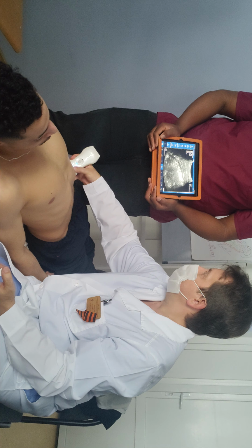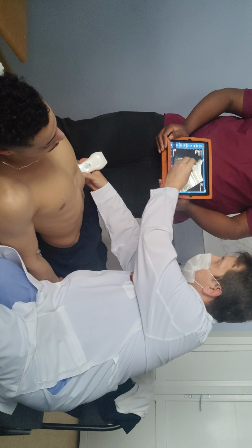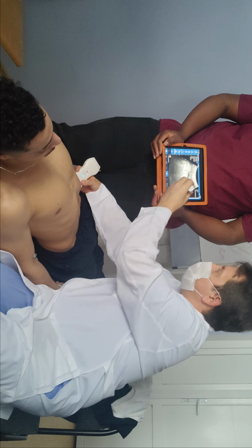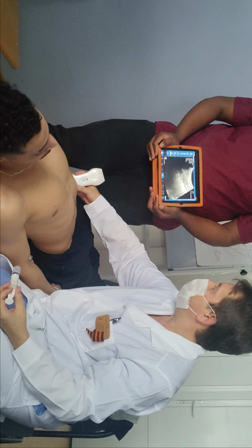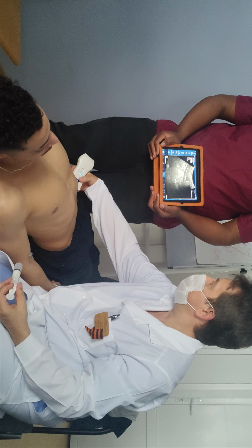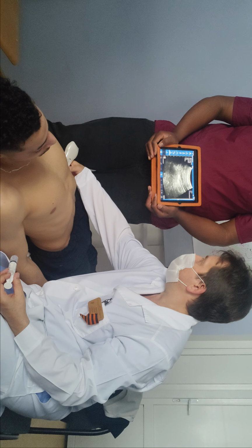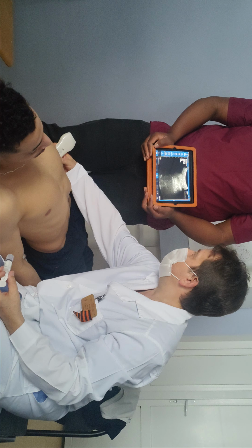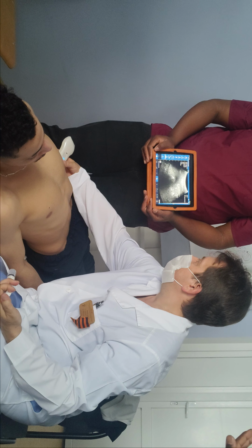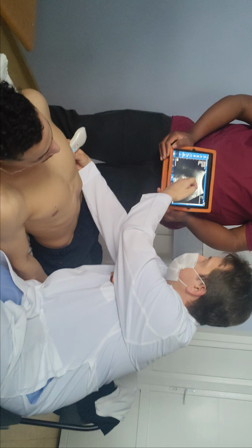Again, you must slide in and find it. At least like here. Those gray areas are muscles, internal parts of bad overview for us. It means that we should find a better picture. We are focusing on kidneys first. Kidneys may be reached from the upper part, from that position. Here is spleen, here is kidney, you see?